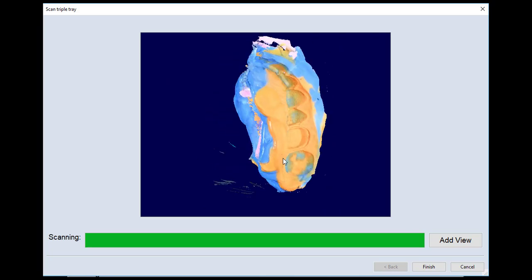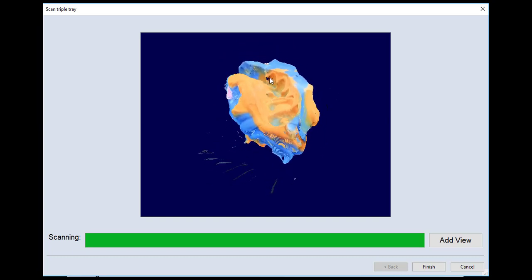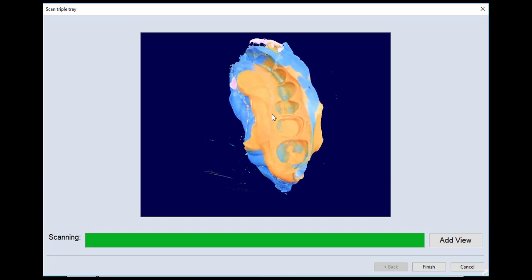However, looking at this, I don't see any missing data based on what I'm seeing right here. A little hole like that is completely irrelevant to doing anything with your crown and bridge. And again, you can ensure that you get the most data possible on the default run.